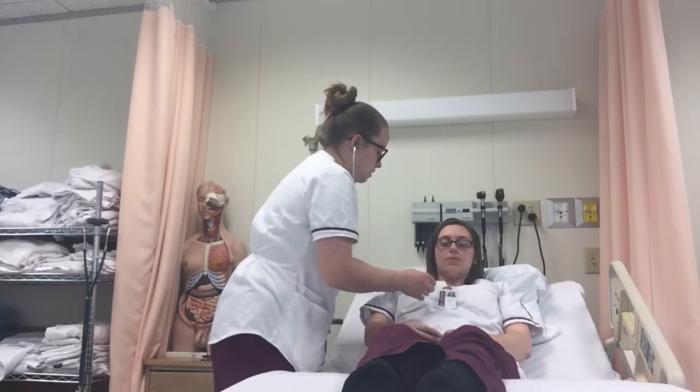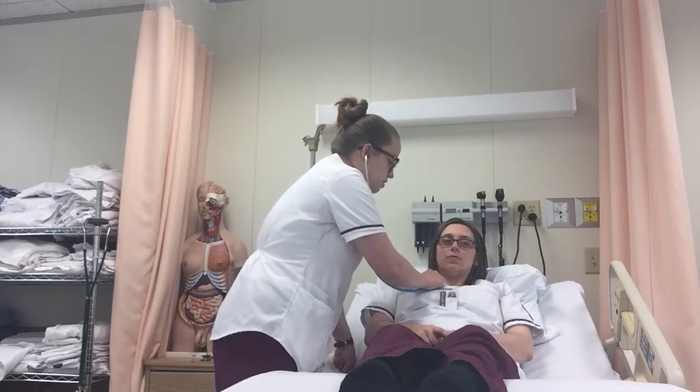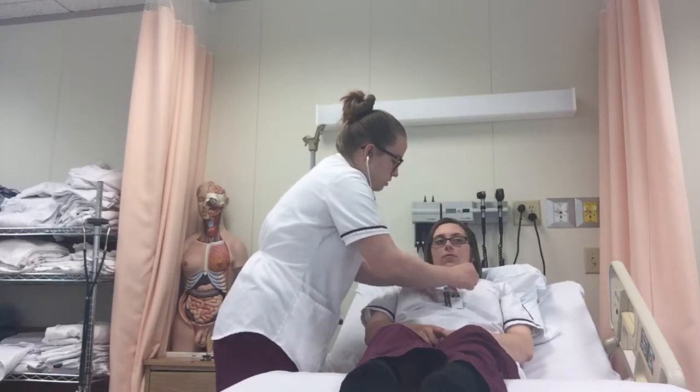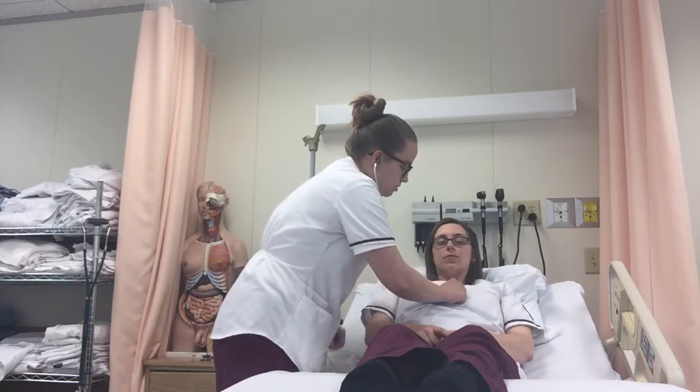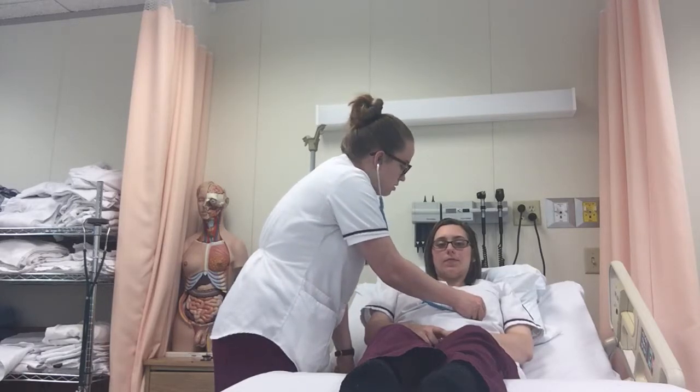And then I'm going to go ahead and listen at the aortic point, the pulmonic, Erb's point, the tricuspid, and the mitral.